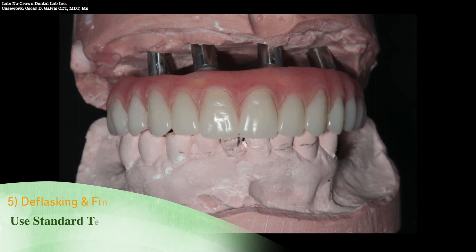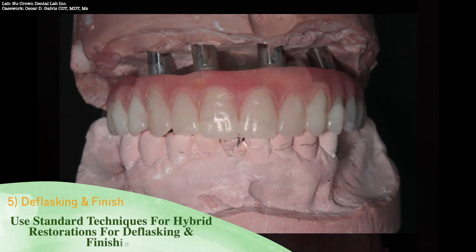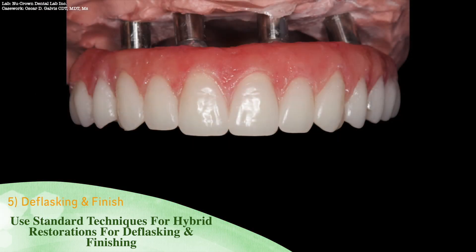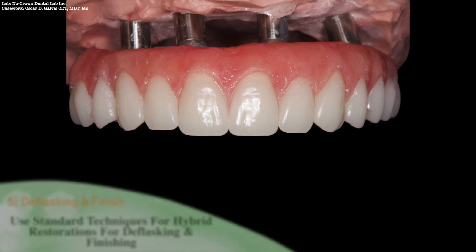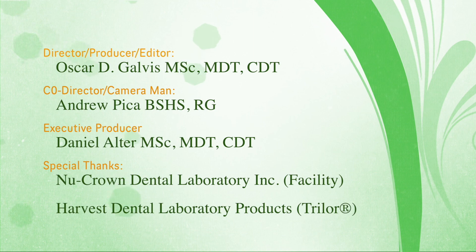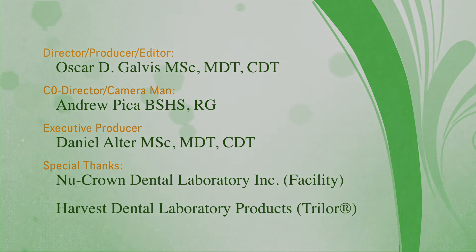You may use standard techniques for hybrid restorations for deflasking and finishing. This case called for composite aesthetics on the facial surfaces. You may use standard techniques to achieve the desired aesthetic results.